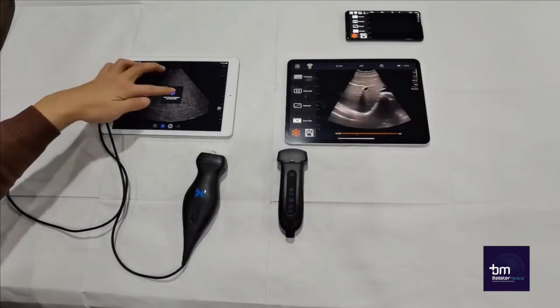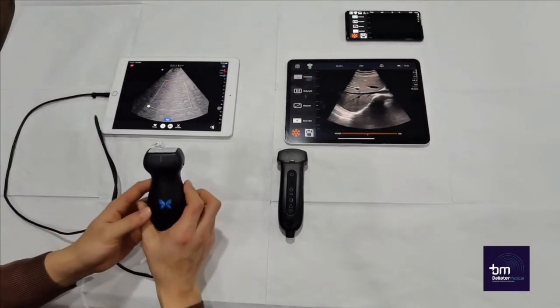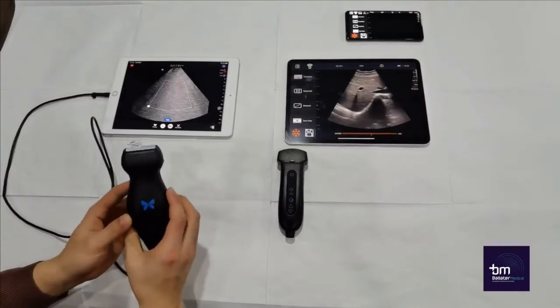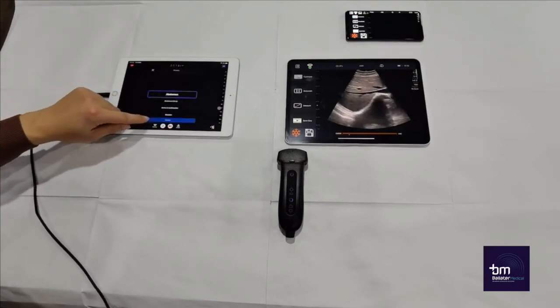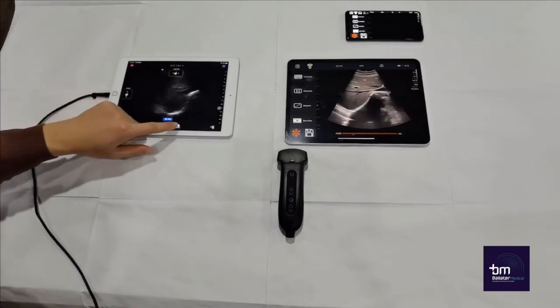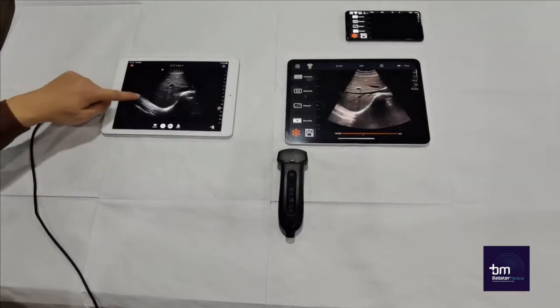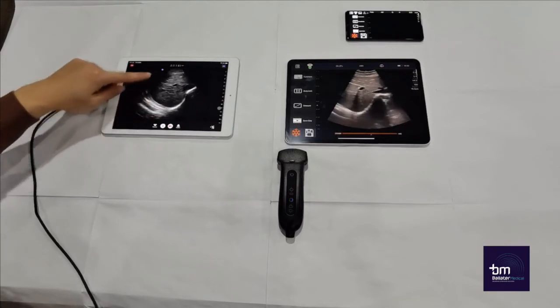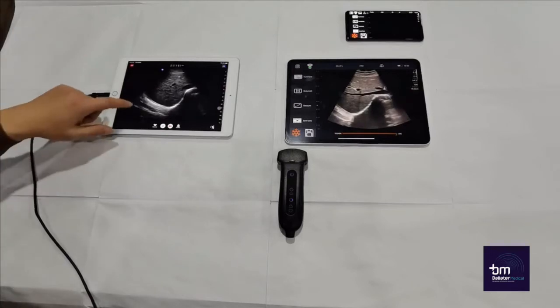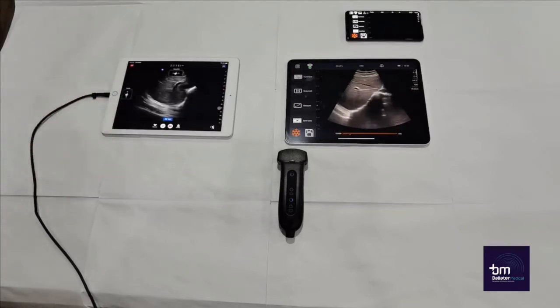Now we will compare the image quality and abilities of the two devices. First is the Butterfly IQ. You can see that the preset is abdomen and the mode is B mode. You can also see that you can only change the depth, the TGC and the gain. You therefore don't have a lot of choices in order to optimise your own presets, as all the settings are limited within certain parameters.